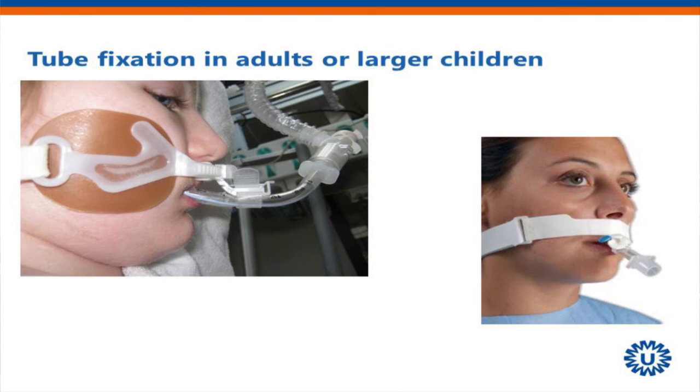But how do we fixate our tubes? How do you fixate your tube? Do you fixate it with a plaster or with a tube lint? Which method do you choose? Tape. Yeah, we use tape also. Anybody using something else? Use the Neo Bar. The Neo Bar. Is it this one? No. Something like it? Yeah. It's something like this, but smaller. This also isn't on your face.